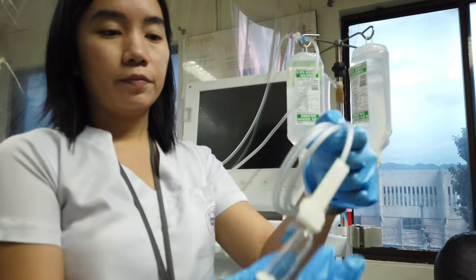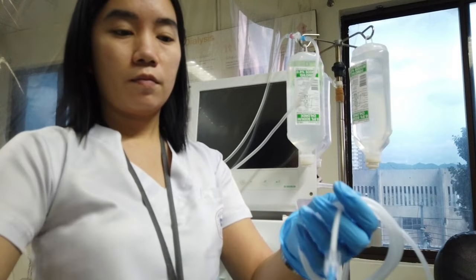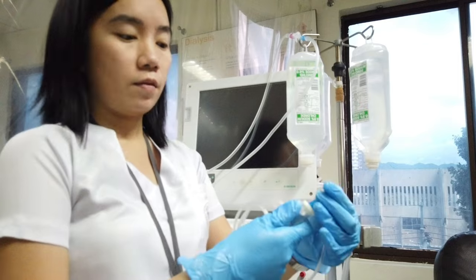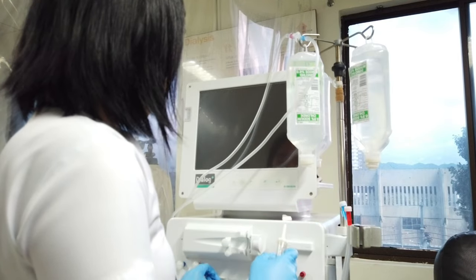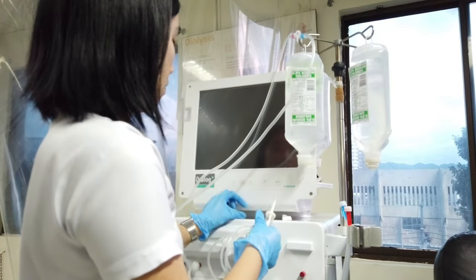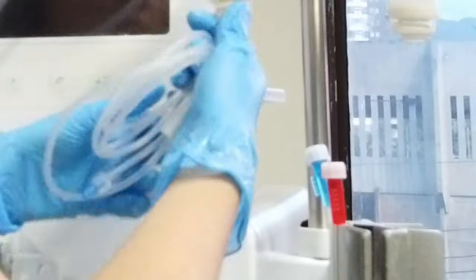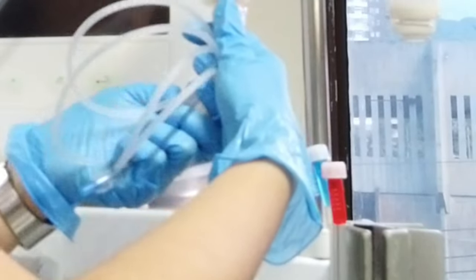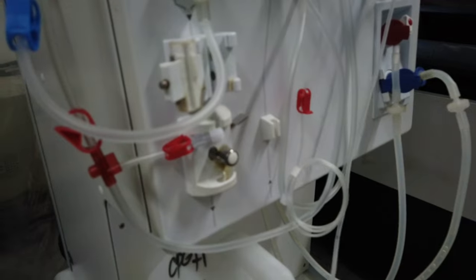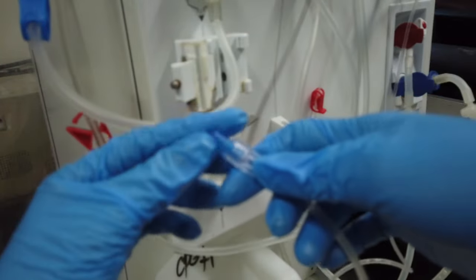Next up, IV infusion line. Remove the paper cord tie. Remove the spike cover. Open the saline. Then spike the saline. Close the roller clamp. Whichever you do first, it's your call. Then connect the infusion end to the saline port of the arterial line.